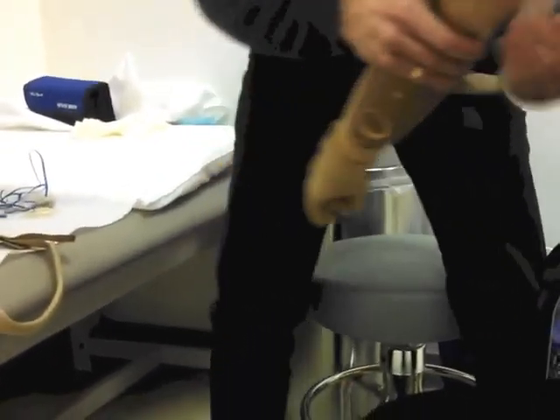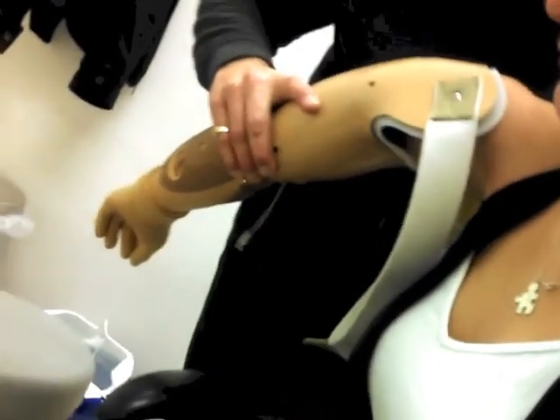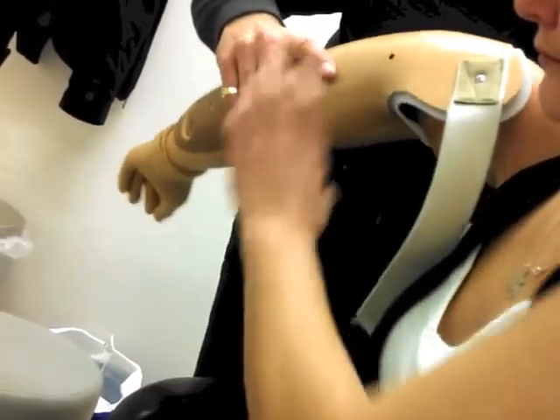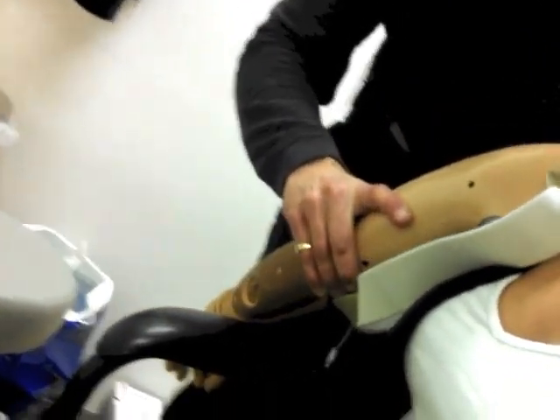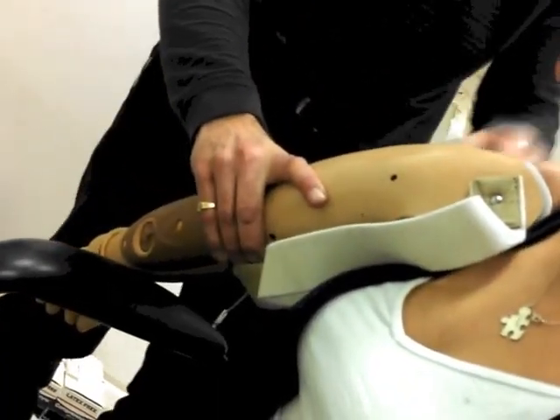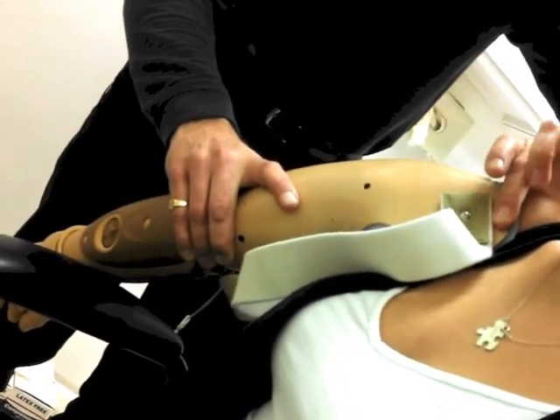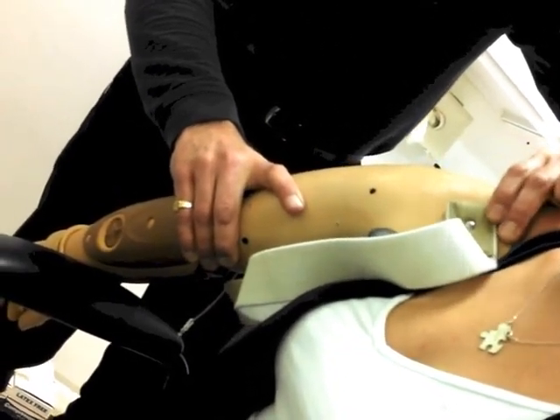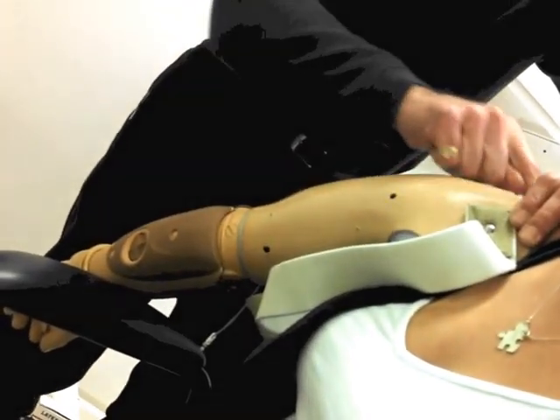Let me put this against you — just slide your arm in here, just like that. Relax your arm. This is where it would sit, just like this. See how it comes up just like this? This would be tighter on you obviously, but it would be about this tight — up against your outer arm, just like that.